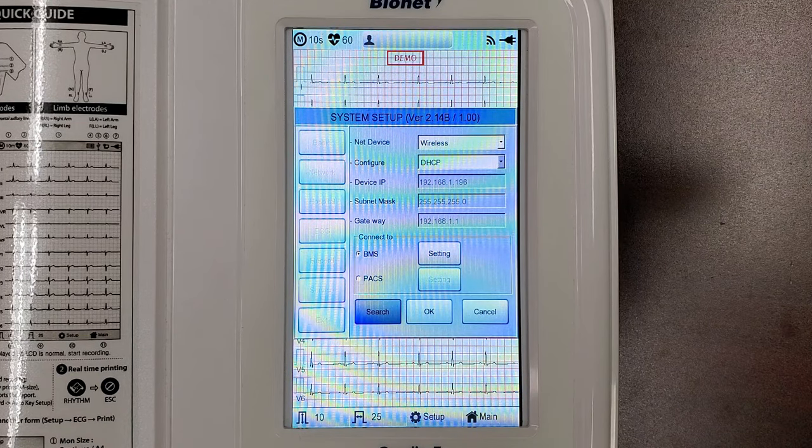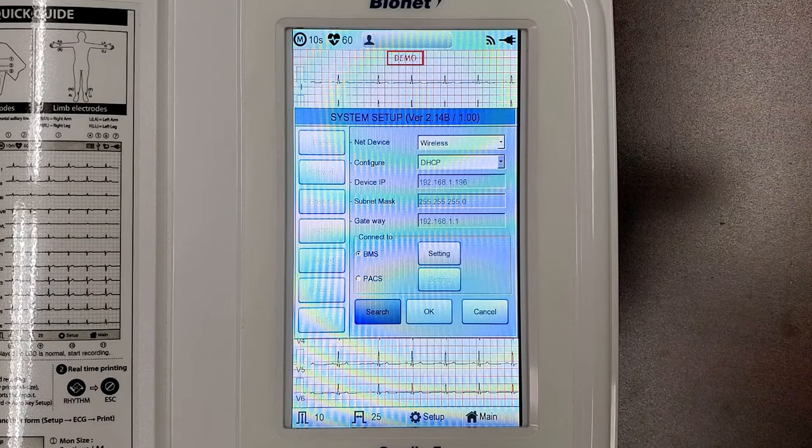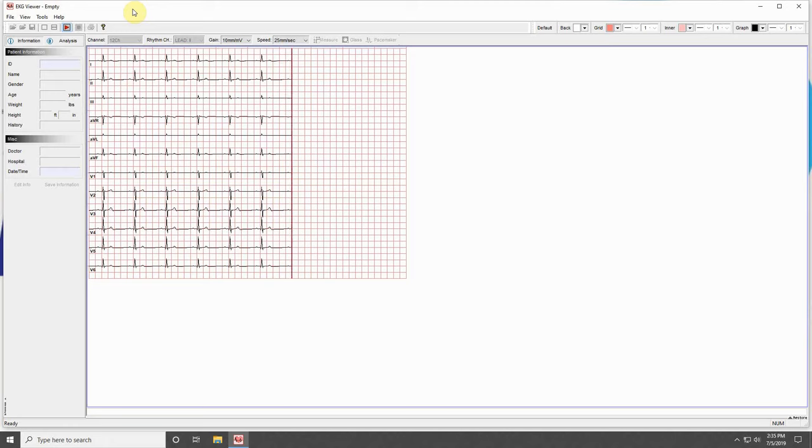Hit Close once again, and follow the remaining steps for the wired connection by inputting your computer's IP address in your machine, and your machine's IP address in your computer. Once this is done, press the red Play button at the top of your EKG viewer program, and the scanning red bar confirms your success. Congratulations on your wireless connection!